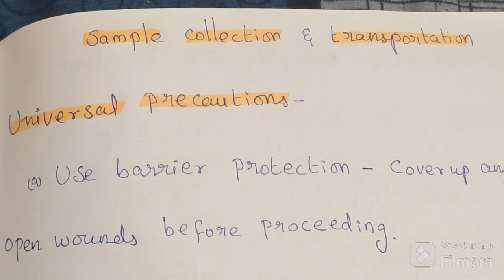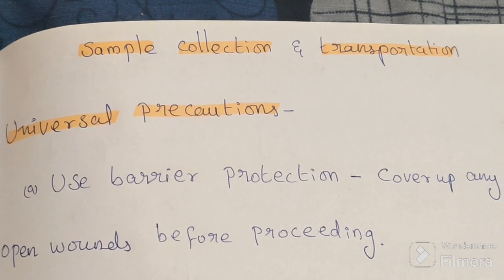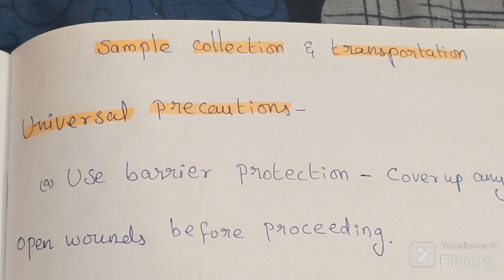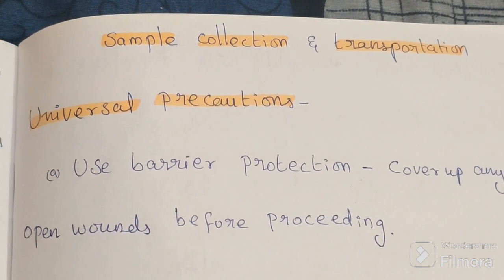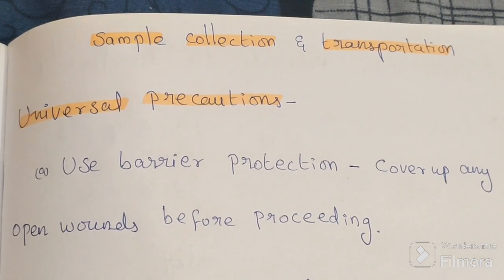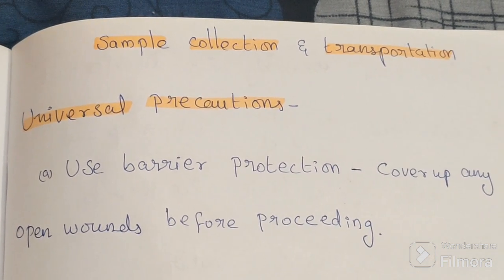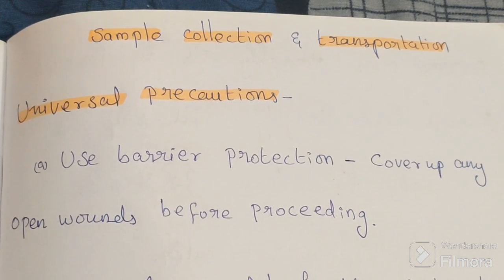In this video, we'll discuss sample collection and transportation. Without any universal precaution, we don't go for any other work, mostly in hospital. So first we want to know universal precaution. What are the universal precautions you should take while collecting a sample?